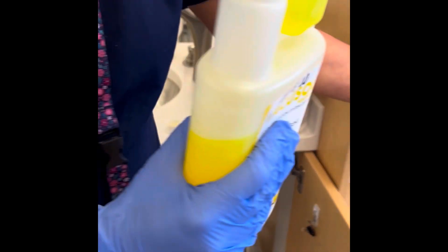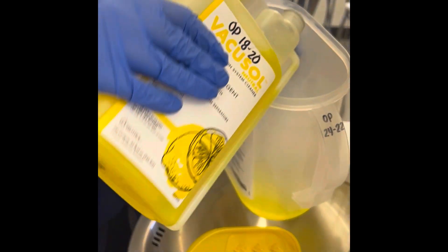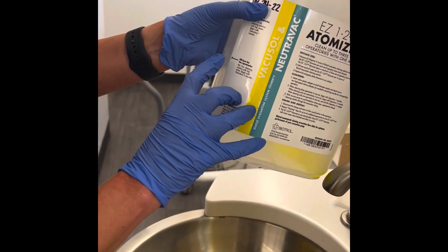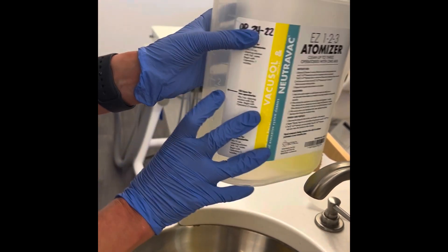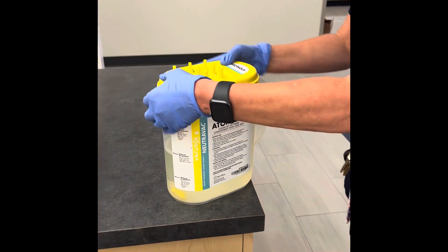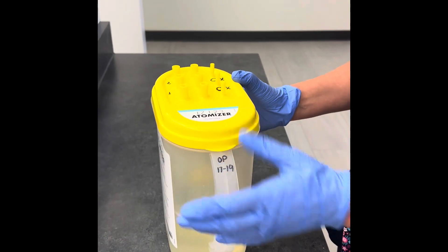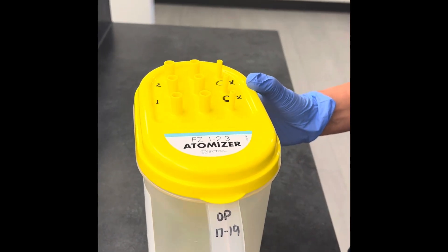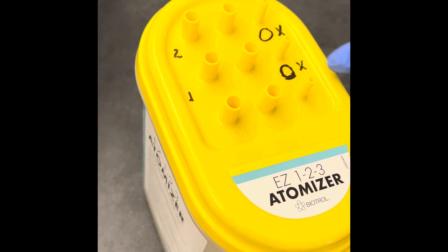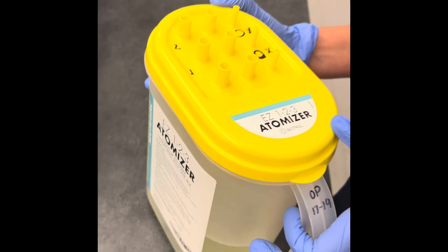You pour it in the bucket and then fill it with water for the two operatories up to the fill line. You place the top on. Since we share two operatories per bucket, which is located under the sink, we use Operatory 2 and 3 to suction the material.